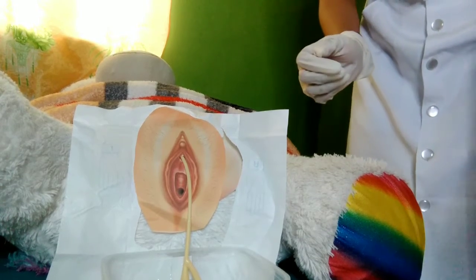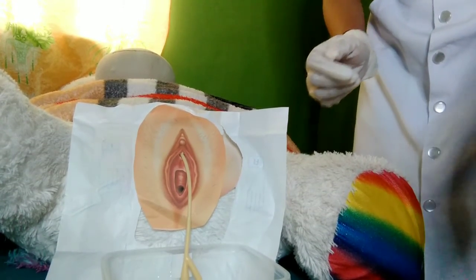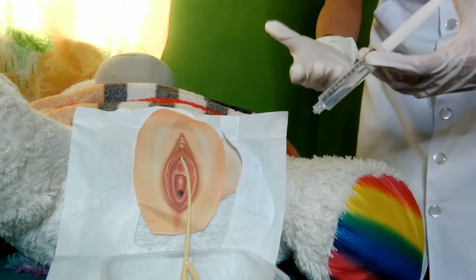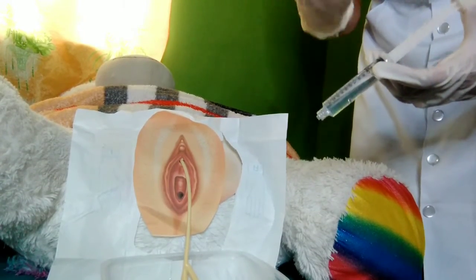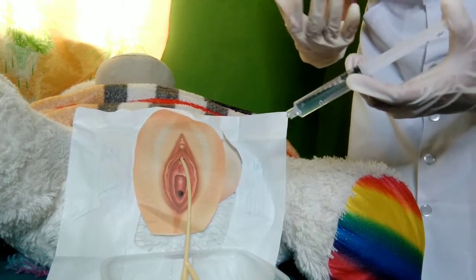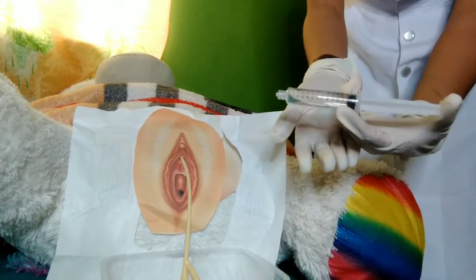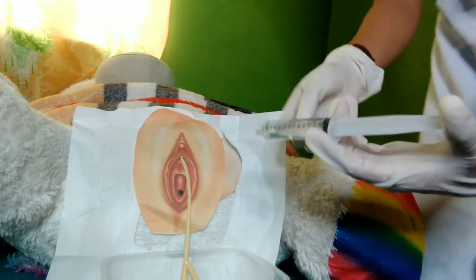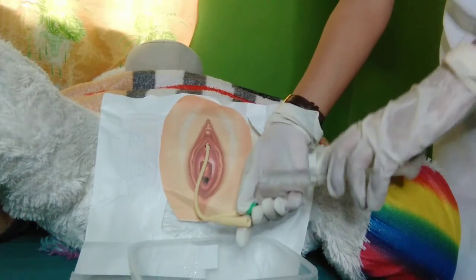So slowly inflate the balloon for indwelling catheters according to the catheter size using a prefilled syringe. This is the prefilled syringe, and the size of the balloon is marked on the catheter port. So slowly inflate the balloon.